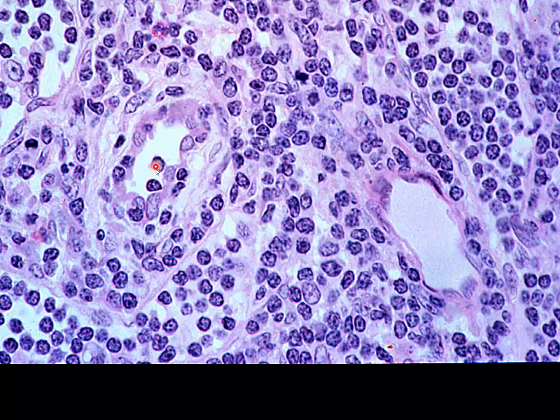And we actually have two, I believe these are lymphocytes that are present in the lumen. And this one, you see how it's almost teardrop shaped. This one is either squeezing out of or squeezing into this high endothelial venule. That's fairly characteristic of a shape of a cell that's undergoing diapedesis. In this one, I can't tell which direction this particular cell is moving.